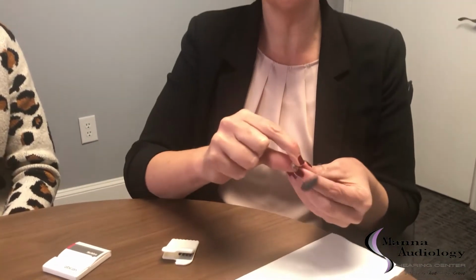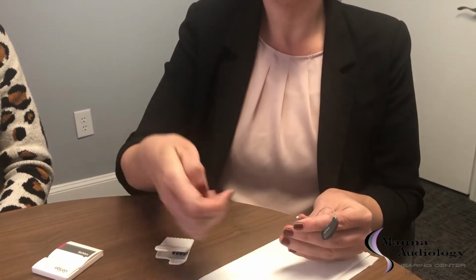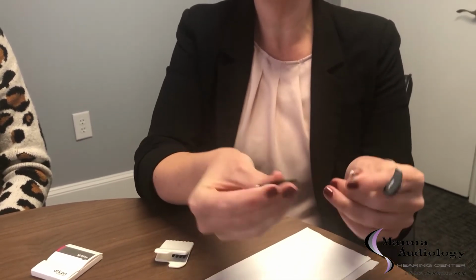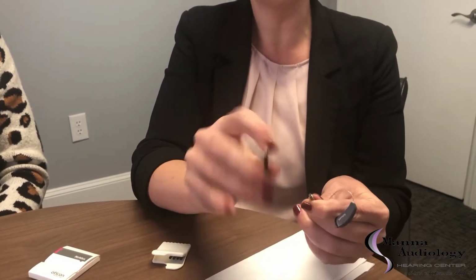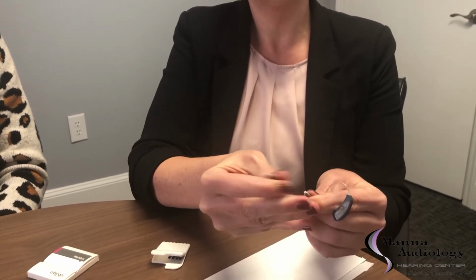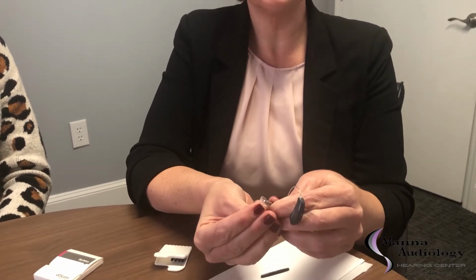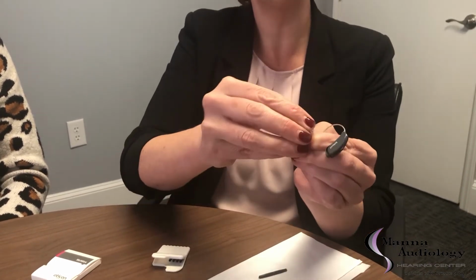Now, Resound uses a black stick, and very similar to the Oticon. First thing we wanna do is take our tissue, we're gonna pinch that dome, pull it off. With the black stick, you have a removal tool on one end and the replacement on the other. You're gonna simply snap it right into place. You'll feel it get tight. Pull the old one out, flip it over, pop the new one in. And as far as putting the dome back on, just like Oticon, you're gonna start at an angle, you're gonna slide it over, pop it on, press down in that center to make sure it's on nice and secure.